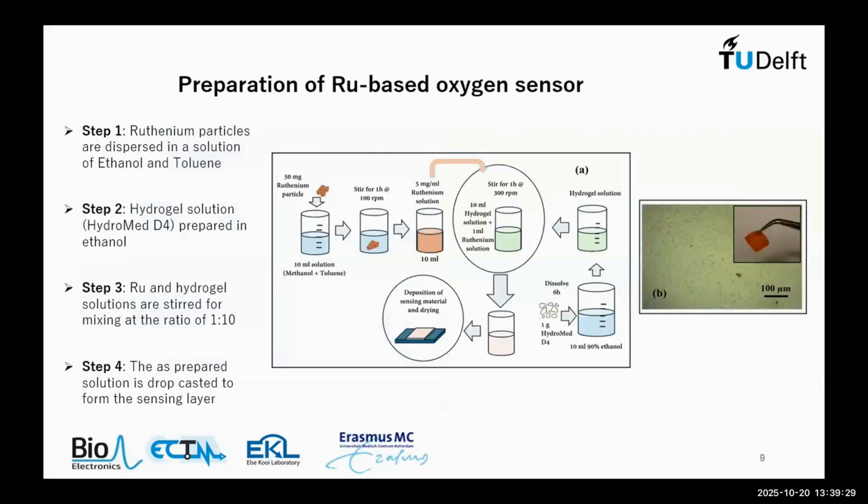And this is what we did. We actually moved across to a hydrogel here. And this is ruthenium here. And I won't go through all the details here, but basically we mix the ruthenium particles into this solution here. And we go round this cycle here. And we get this film here, which is a hydrogel containing ruthenium. And it is also a porous hydrogel, so the oxygen can get into it.